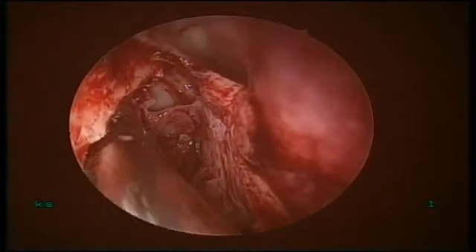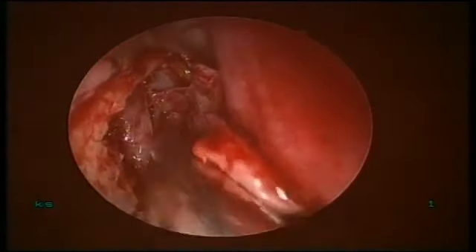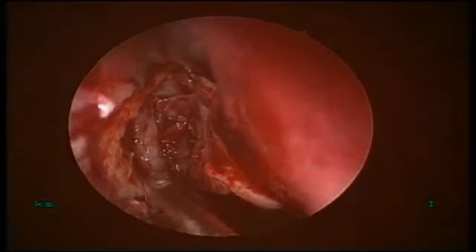Anyway, I am very particular about the superior exposure, because if you go particularly superiorly, you rule out the possibility of restenosis by looking at the common canaliculus from here and marsupializing in that region properly.